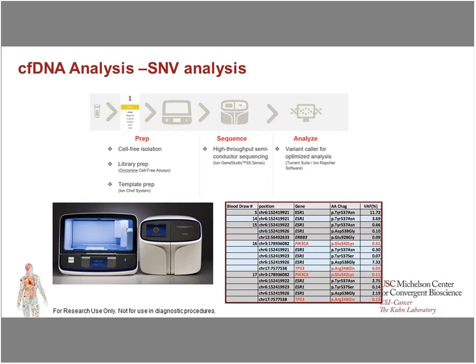In our lab, we're using Ion Chef system for the overnight templating. Then on the second day morning, the high-throughput semiconductor sequencing on Ion S5 sequencer. So the last step is using the integrated informatics solution for variant analysis on Ion Reporter.